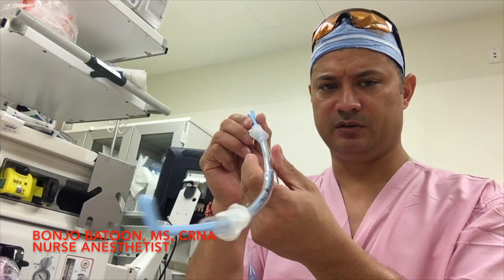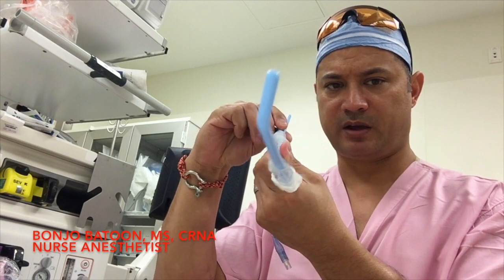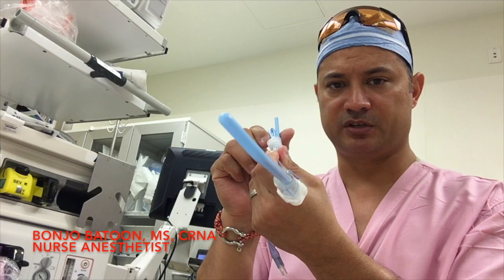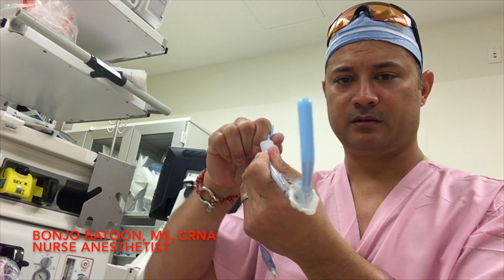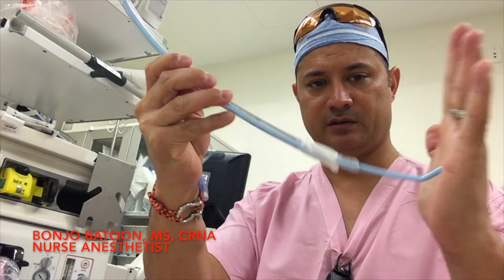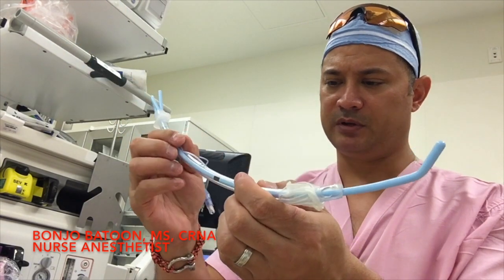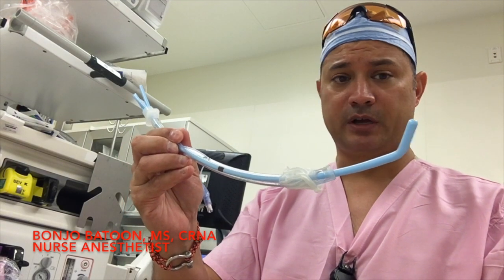The other thing about this too is that you can actually change the direction of the tip simply by taking out the back end and spinning it. It will actually stabilize the bougie in the direction that you wish to guide it — so you can go left, right, or whatever you want to do with it, and it just stays in that position. The bougie will not back out. It's a very smooth and easy motion once you get it down.